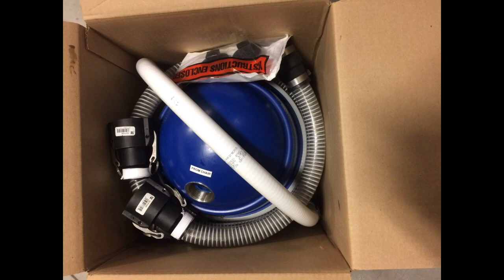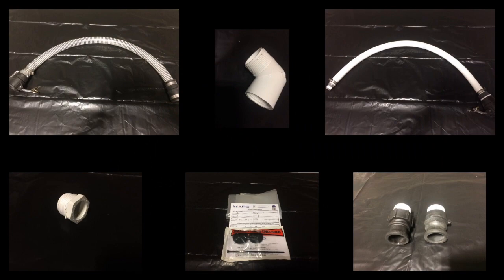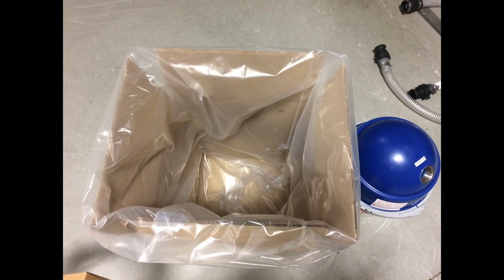Open the Liberty Boss box to find the Mars amalgam separator upgrade kit. Remove contents from the Liberty Boss box. Remove the stabilizing insert. Line the Liberty Boss box with the provided bag.